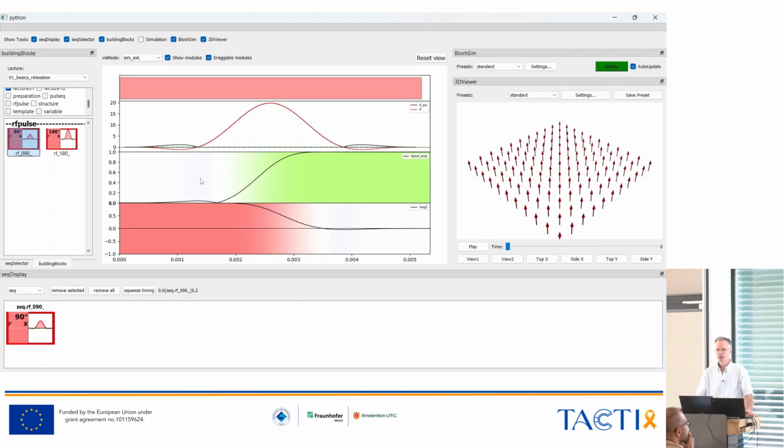And for the transverse magnetization, there are two parameters which can change. One is the intensity, the length of my magnetization, and the other one is the direction. So it could show in all different directions. The direction is encoded by color, and the intensity just by intensity. So you will see that it becomes weaker and weaker over time.